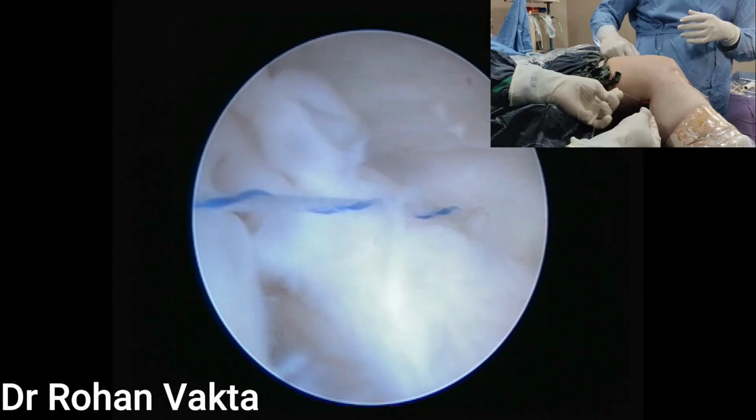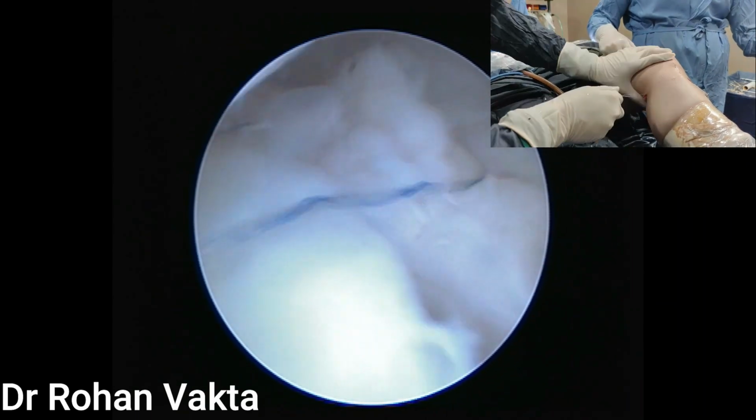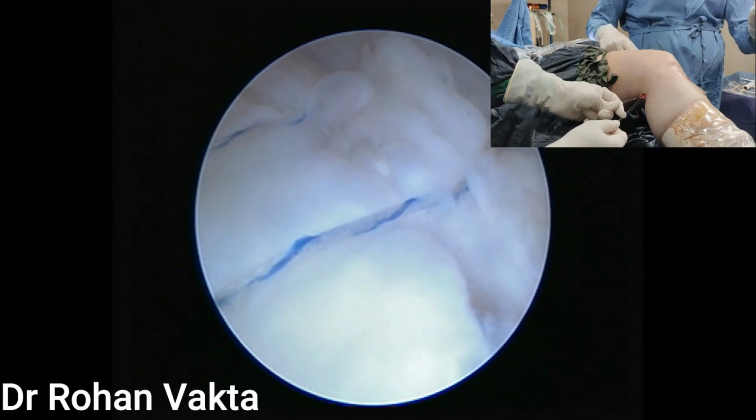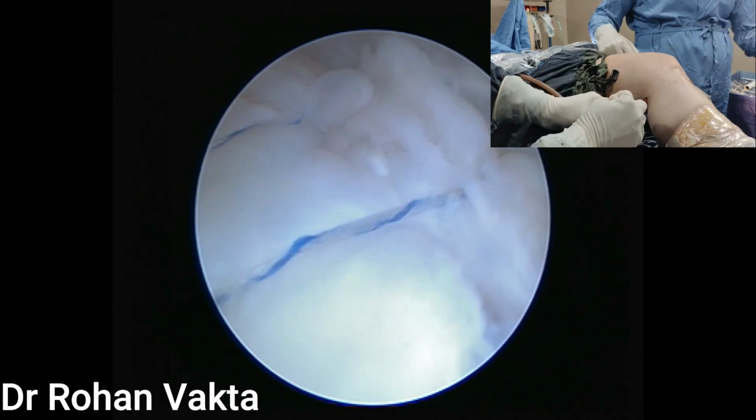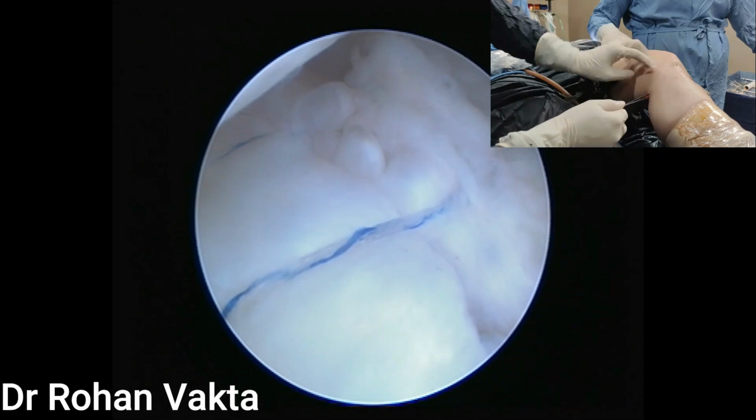Once the needle is passed, from the outside surface the sliding knot is taken, and once the knot is taken, you can see very good compression between the meniscus and the capsule, and the ramp is properly closed.